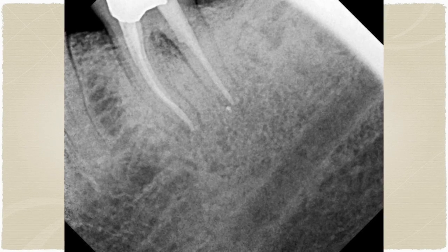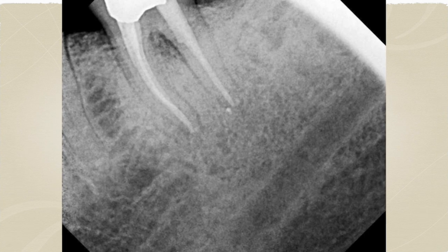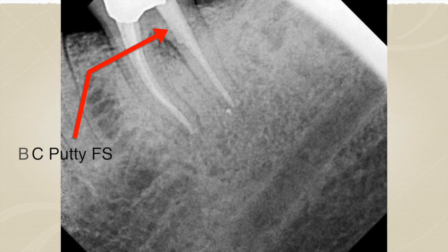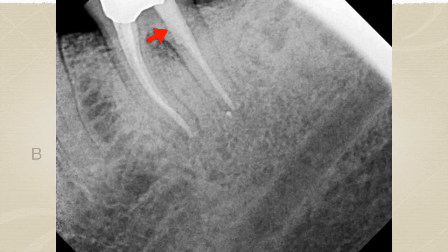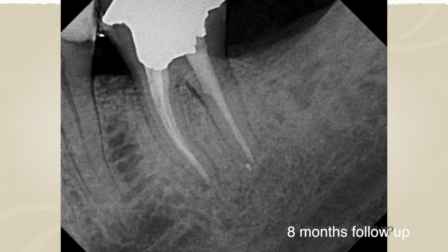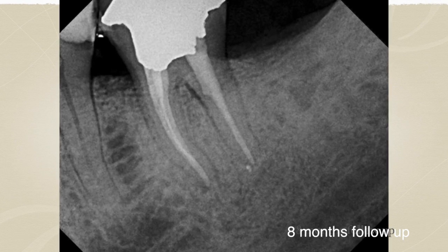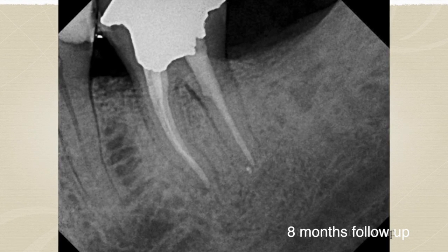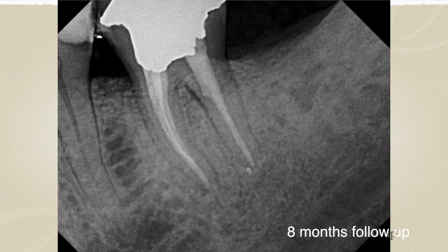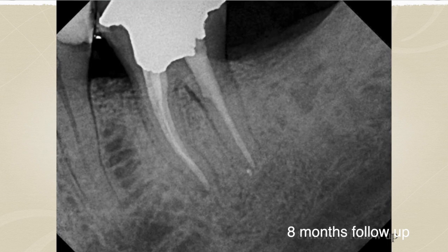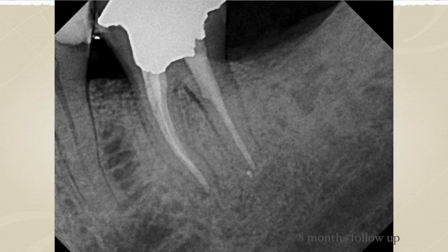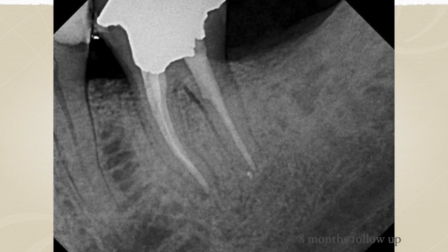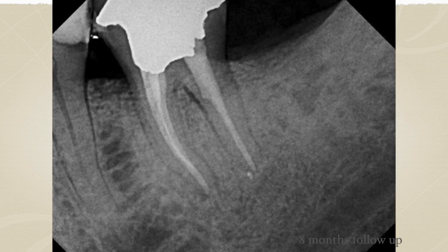This is the immediate post-operative radiograph after removal of the post through the crown and repairing it with the BC Putty. And this is the eight-month follow-up showing healing of the furcal lesion and resolution of the patient's symptoms. No probing is present at this time and healing continues to take place as the bone is filling in. Future radiographs will be obtained and shared.